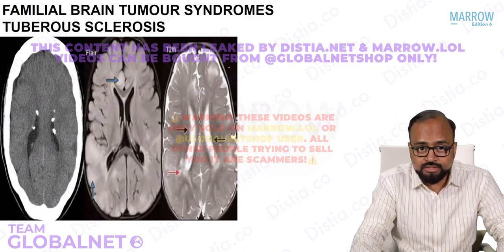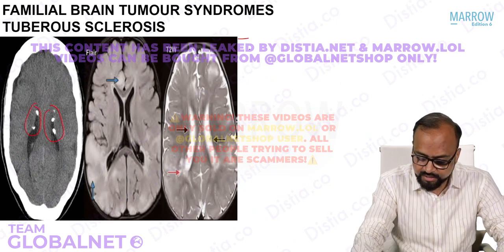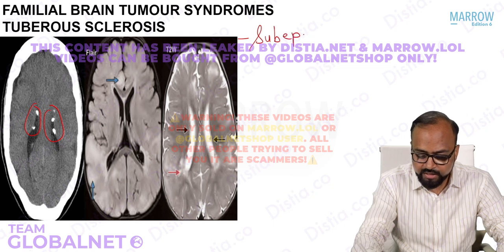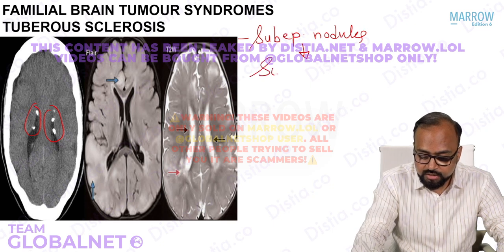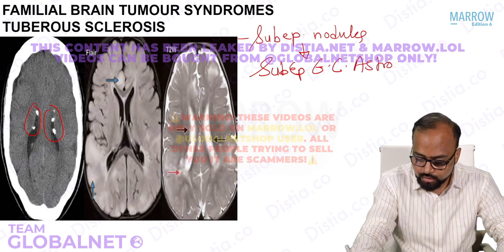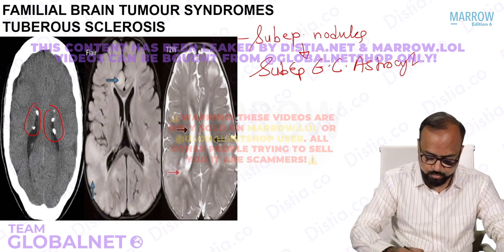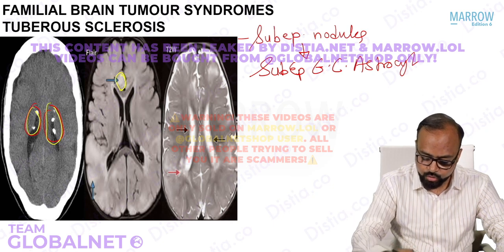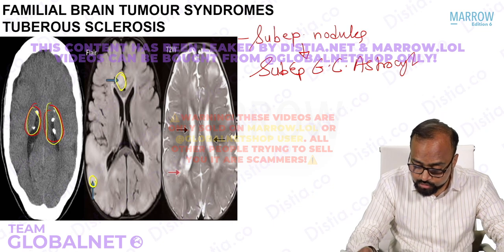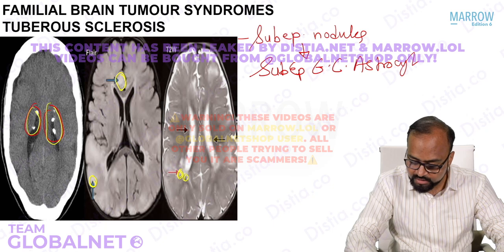Now tuberous sclerosis, we have seen these images before. Tuberous sclerosis is associated with these calcified subependymal nodules, and I told you that this progresses to a tumor. What tumor is it? It is a subependymal giant cell astrocytoma, right? So see here, now in this CT image, the calcified tubers that you are able to see here along the subependymal surface, right? Now these are cortical tubers, so the blue arrows are pointing to cortical tubers which are involved, right? Along with this, these white arrows, some white matter signal abnormalities are also seen, right?